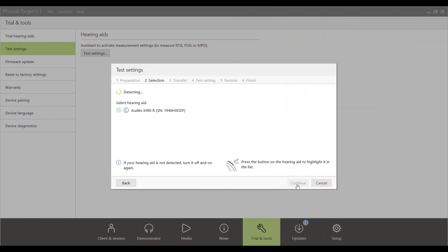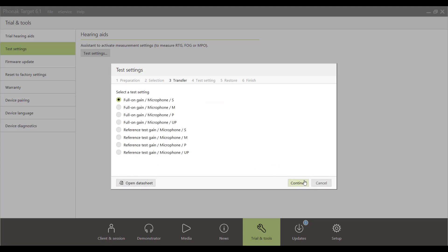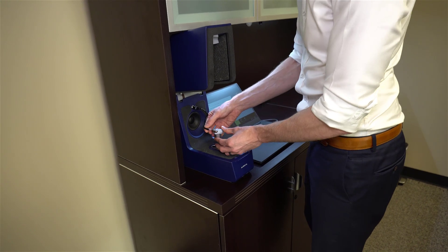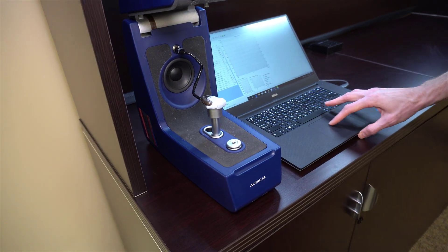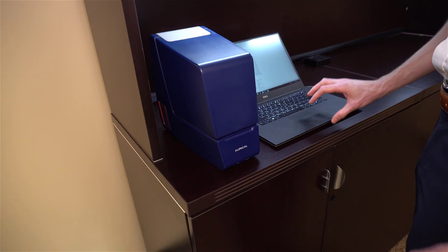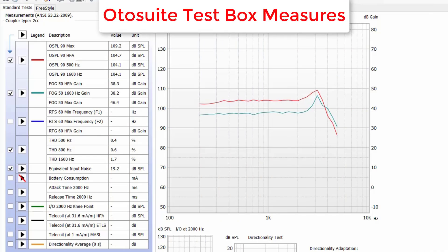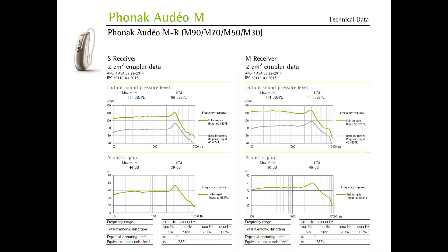In order to perform these measures, we need to prepare a hearing aid for testing in the Aurical test box. This requires that we program the hearing aid to manufacturer test settings. The concept here is that we use the test box to present calibrated signals to the hearing aid programmed to these manufacturer test settings, then record the output, gain, distortion, and noise level to ensure it's functioning within manufacturer specifications. These measurements are presented in graph form and in numerical values. Every new hearing aid comes with a manufacturer's specification sheet that shows the technical data of that hearing aid, and here is an example of what one of those sheets looks like.